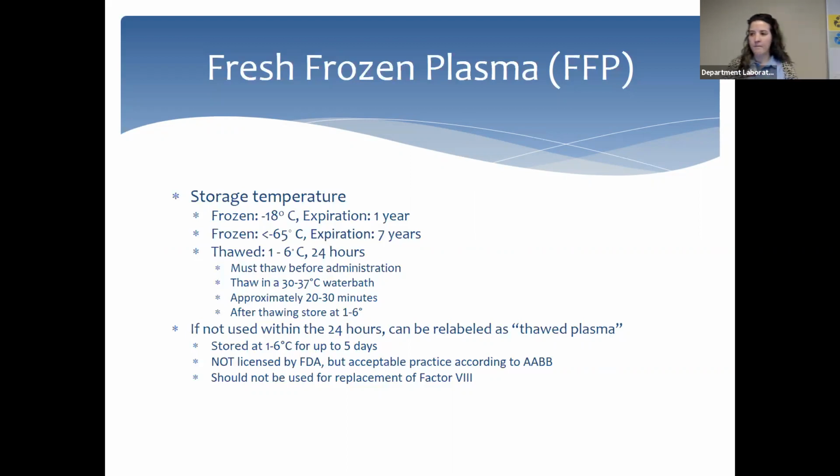So, at UAMS, we did that. We would extend our plasma date to 5 days. We did that. Cite, thank you. That's the word I was looking for. They won't cite you for that.